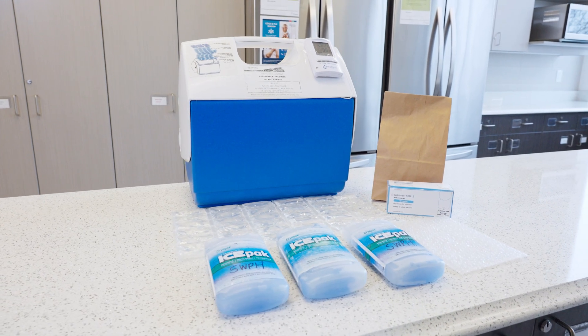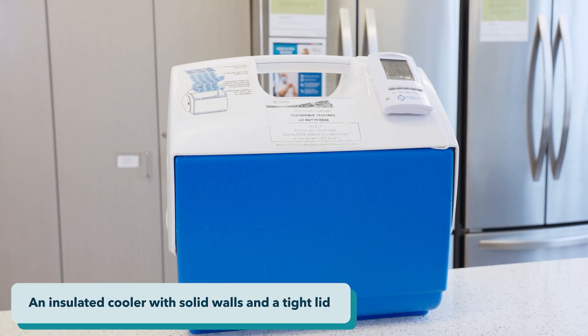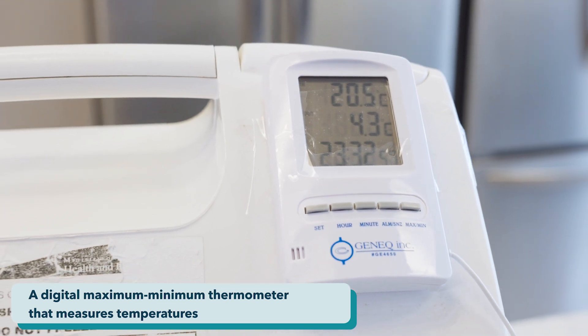When transporting vaccines between sites, to clinics, or between fridges, you need to ensure cold chain temperatures of two to eight degrees are maintained. To do this, you will need an insulated cooler with solid walls and a tight lid, and a digital maximum minimum thermometer that measures temperatures.